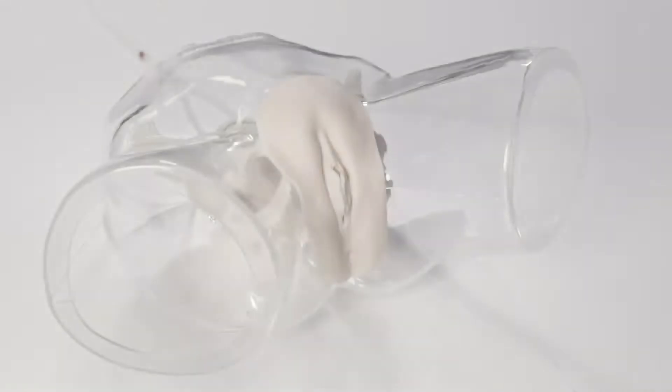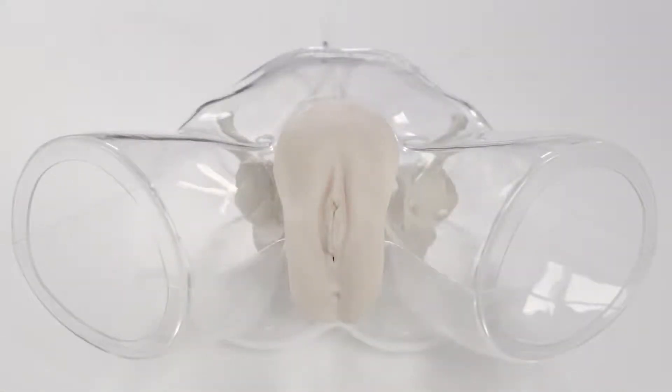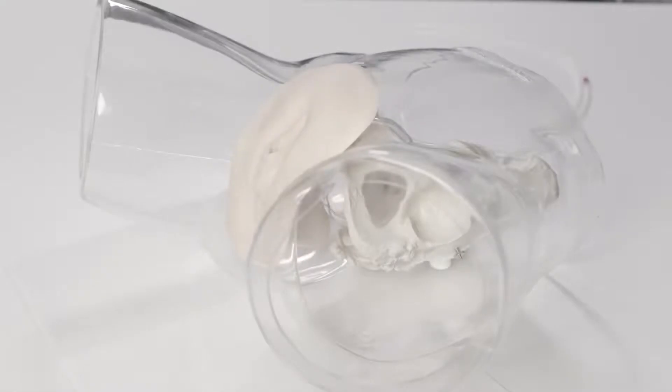This artificial anatomical model closely resembles the morphological characteristics of the female anatomy.